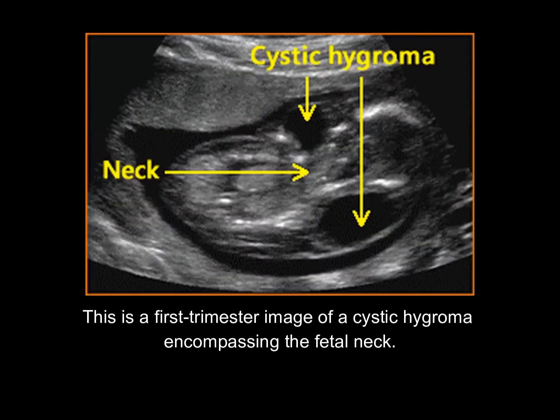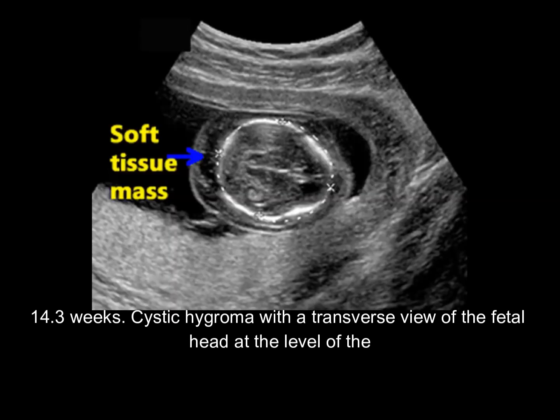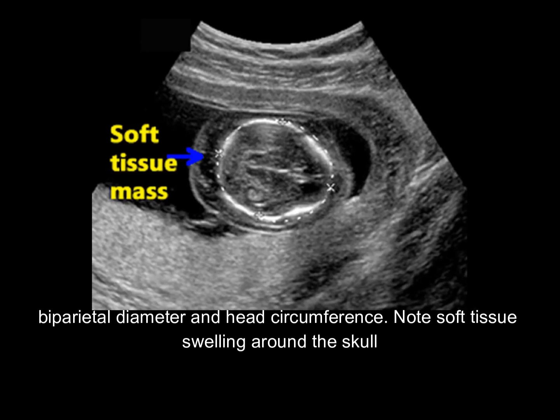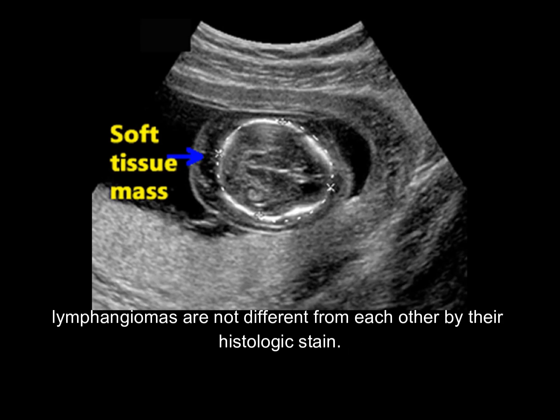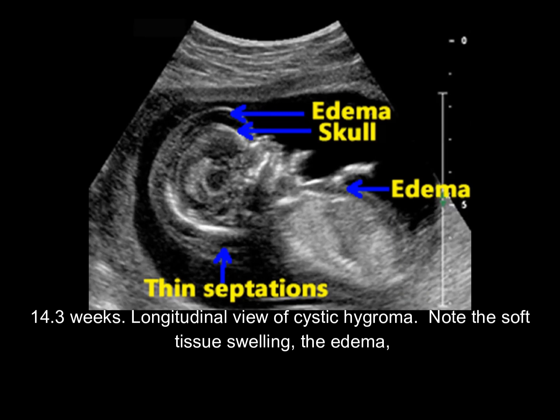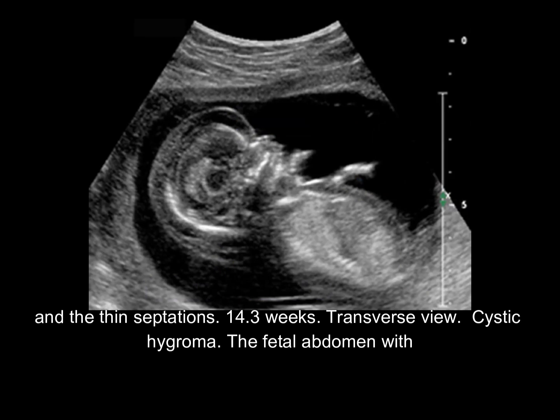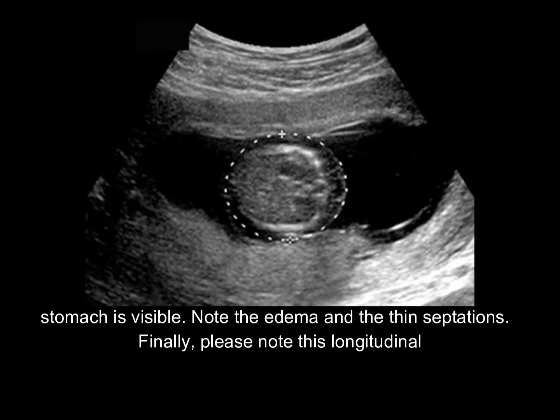This is a first-trimester image of a cystic hygroma encompassing the fetal neck at 14.3 weeks. A transverse view of the fetal head at the level of the biparietal diameter and head circumference shows soft tissue swelling around the skull and the thin septations characteristic of cystic hygroma. A longitudinal view of the cystic hygroma also demonstrates soft tissue swelling, edema, and thin septations. In a transverse view, the fetal abdomen with stomach is visible, again showing edema and thin septations.